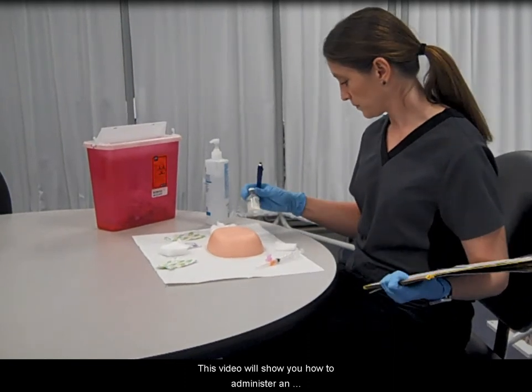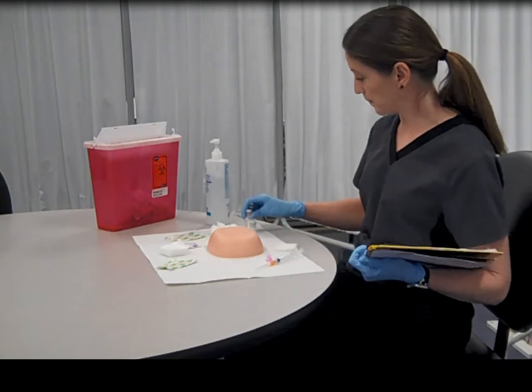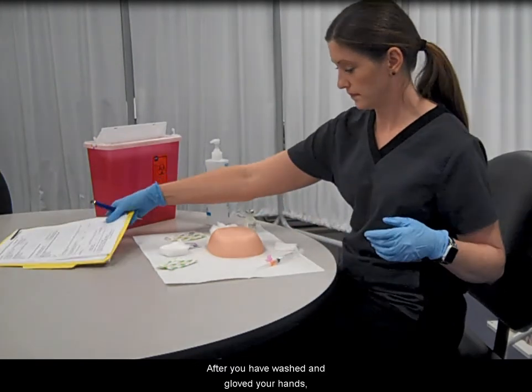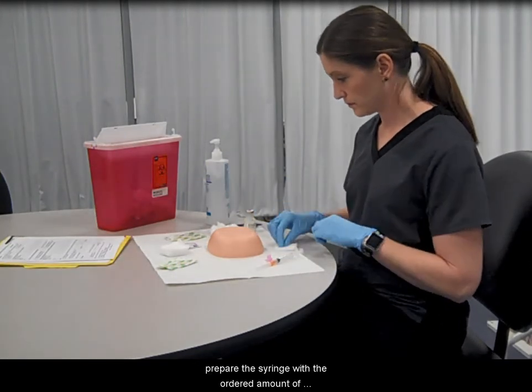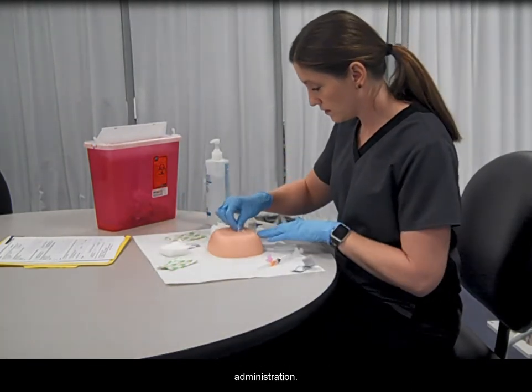This video will show you how to administer an intramuscular injection by Z-Track method. After you have washed and gloved your hands, prepare the syringe with the ordered amount of medication, verifying all ordered doses or dosages prior to the administration.